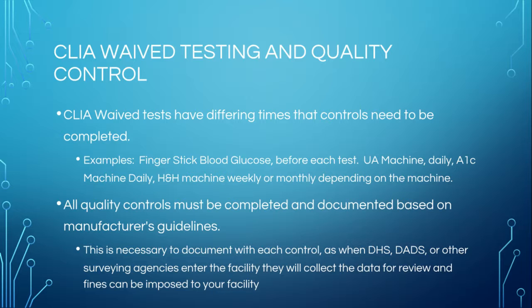It's very important, because if you're supposed to have done the control that day and you didn't do it, and I'm coming in just to do my quality checks on you, then I'm going to have to write you up because you didn't do what you were required to do. So just be sure that you're doing your controls, and it saves everybody time and money in the end.